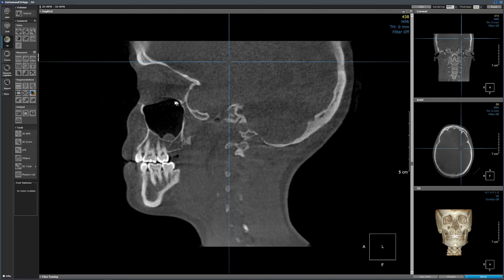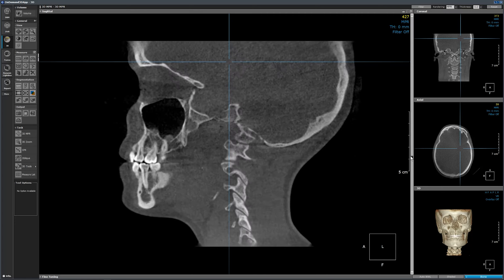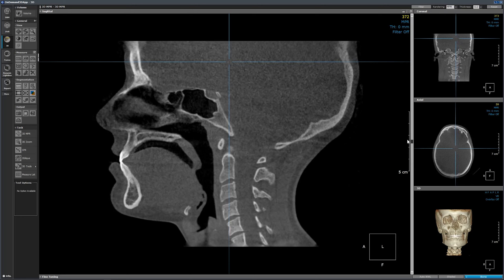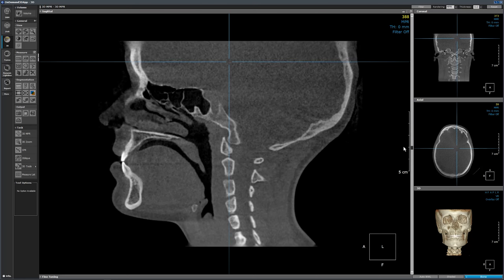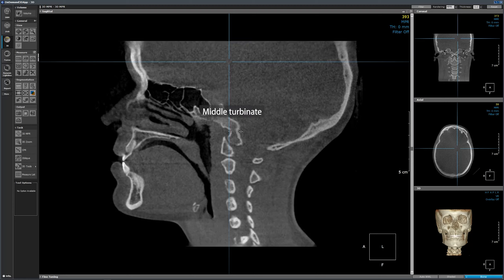We have the left maxillary sinus. There is a soft tissue density mass which is a disease process — we will talk about this in the fall semester. We have picked up the left orbit. These are the ethmoid air cells, the inferior turbinate, and the middle turbinate.